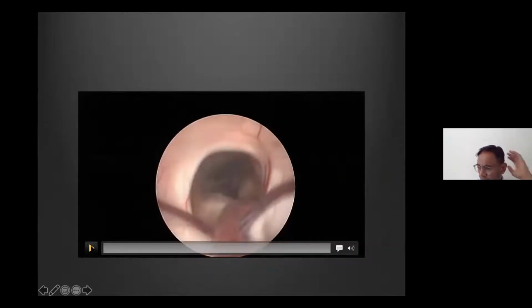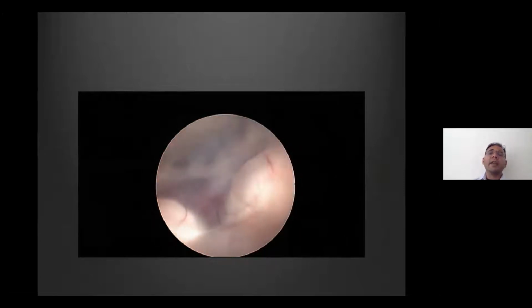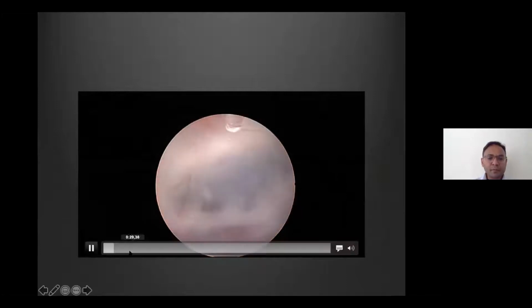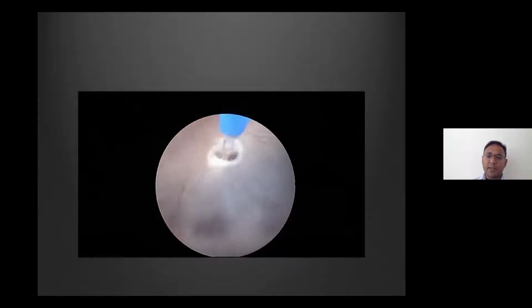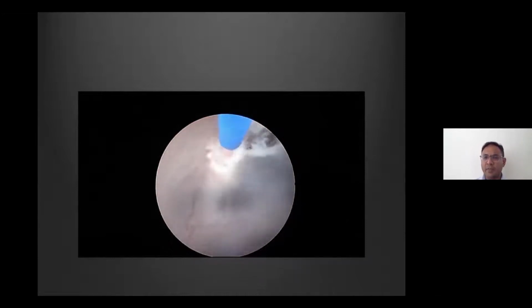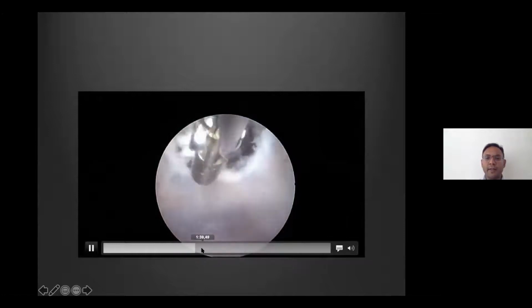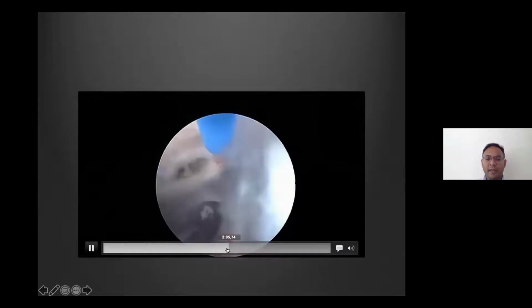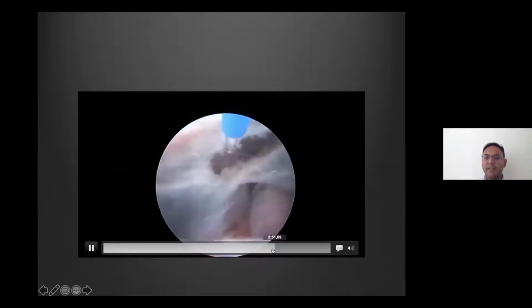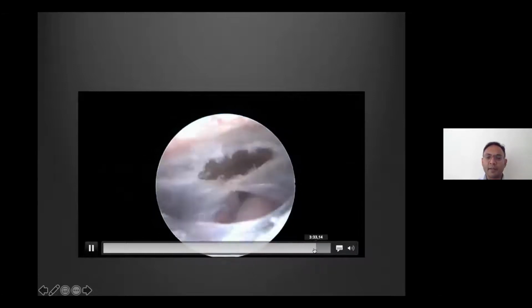So I'm going to show this video. It's a patient who had a retroclival cyst, and we had to go transventricular, do a third ventriculostomy, and then fenestrate, at least open the membranes, a case I did with a colleague of mine, Martin Schumann. Martin Schumann and Hans Ludwig often advocate using the laser for third ventriculostomies. I'm not a huge fan of that, but in this case, we used the laser because we didn't want to change too many instruments. So this was an opening of the floor, and the main goal to show here is the fenestration of the membrane within the retroclival space. So that was nicely fenestrated, and you can see we used the laser here. But again, that's quite nice if you can, but not an absolute must. Okay, so I think it looks quite clear that that's been opened.